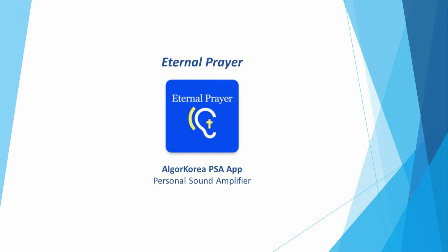Welcome to the tutorial for Eternal Prayer, AlgorKorea PSA app, Personal Sound Amplifier.